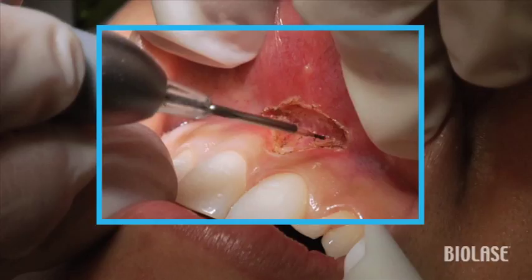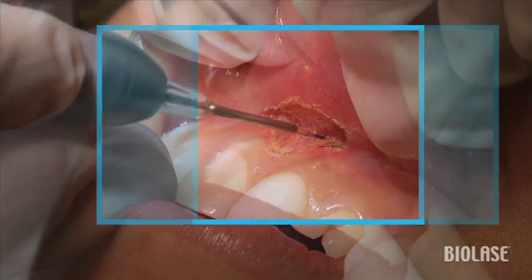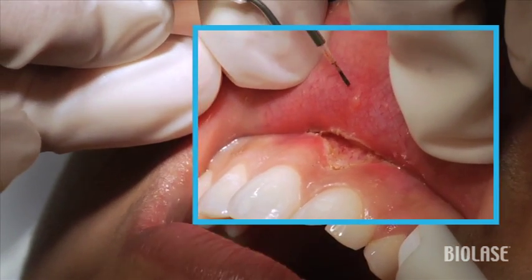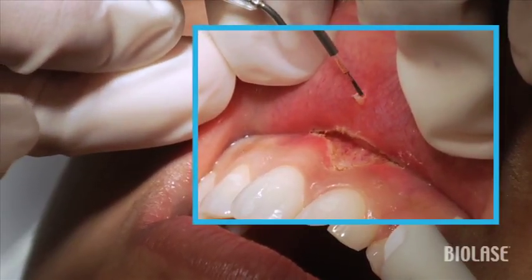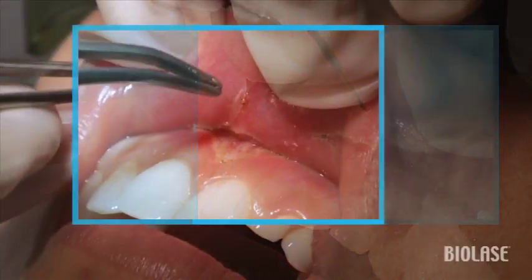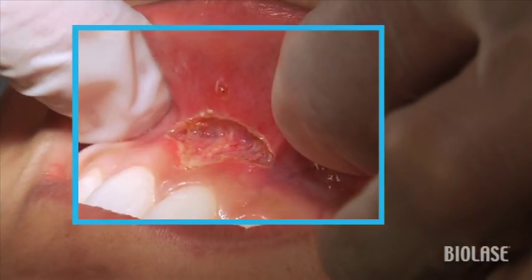Don't be alarmed at the size of some of these surgeries that you end up performing. This is a good time to note that there's a little nodule next to the surgical site as well, and we're going to remove this using the iLase in the same frenectomy setting. Then using a tissue pickup, we can remove this lesion very easily.